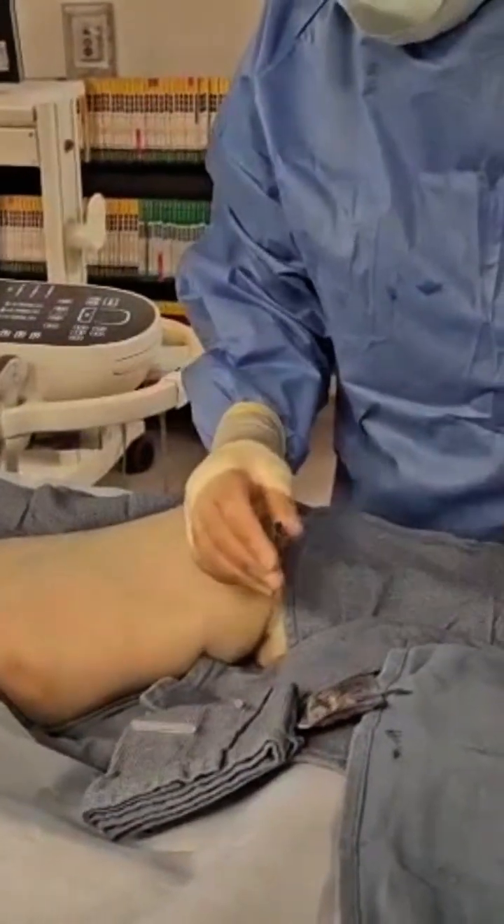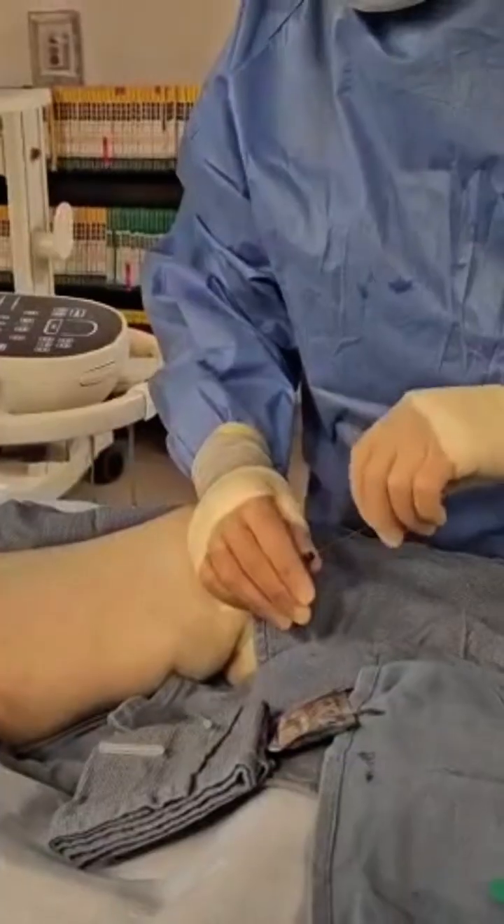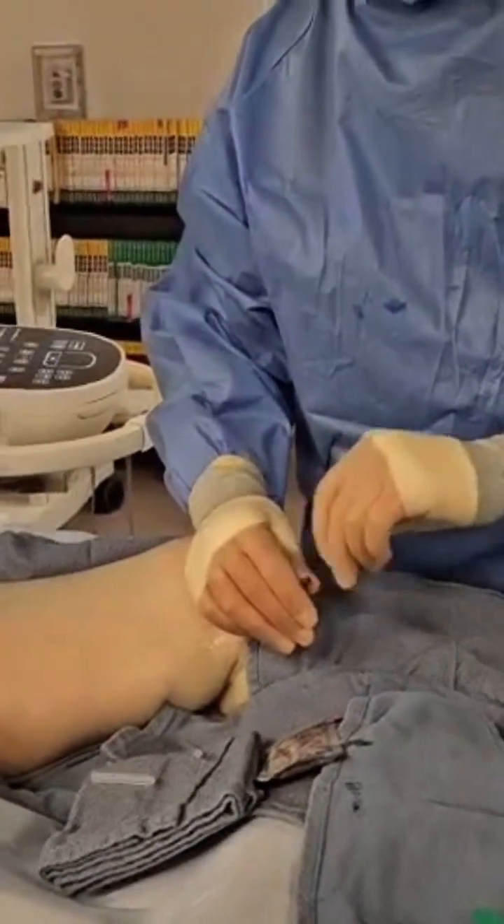We'll go ahead and put our micro wire in. Again, if you use a micropuncture needle it usually tends to be too short. I can feel it's going up nice and smooth — we're in the vein.